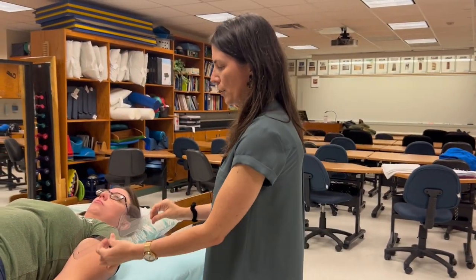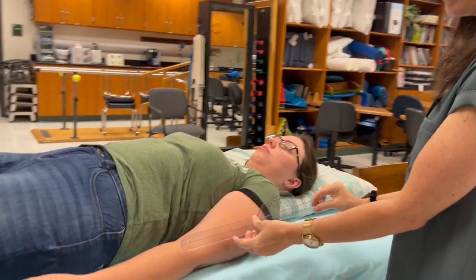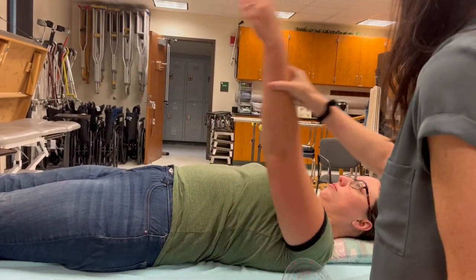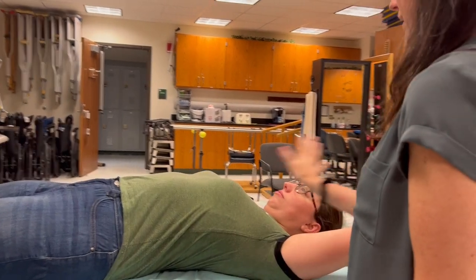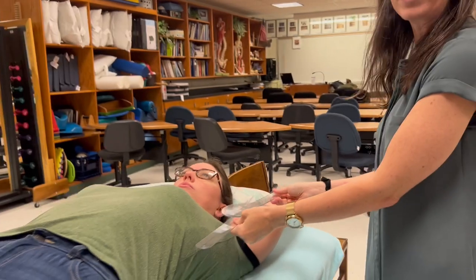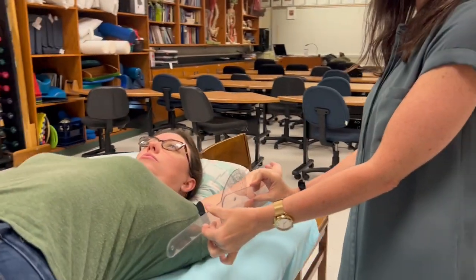There are a couple other things to talk about with flexion. Make sure that when you're measuring flexion your goniometer is in the sagittal plane, because a common error is that someone will have the patient flex and forget - because this looks very much like the end range for abduction - and they'll place the goniometer in the frontal plane. So make sure your goniometer is in the sagittal plane.